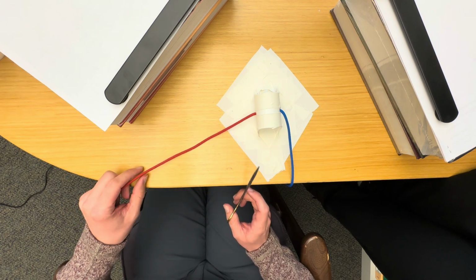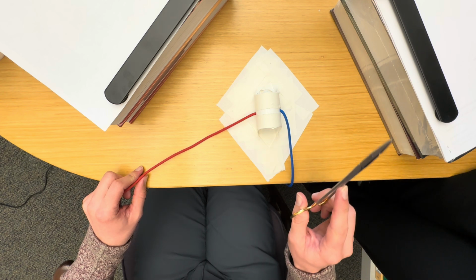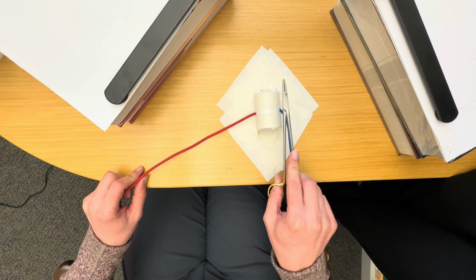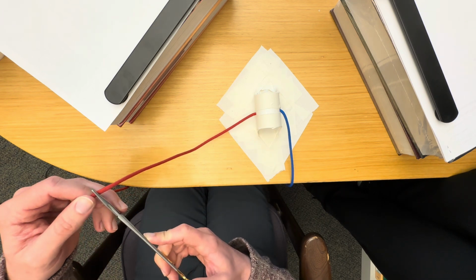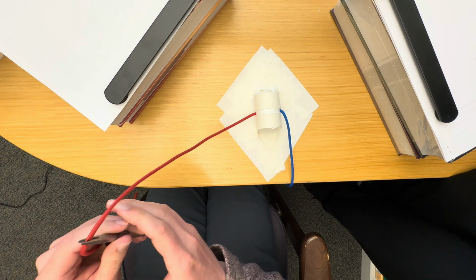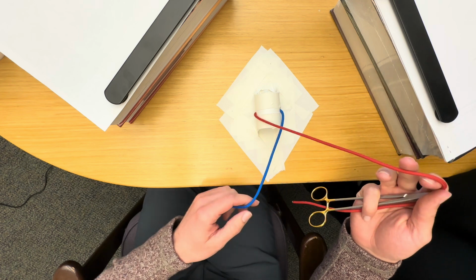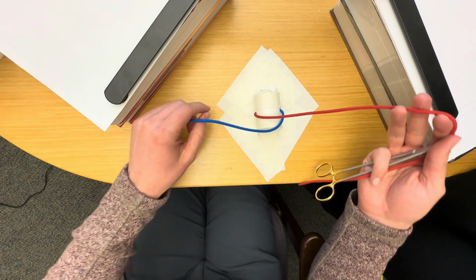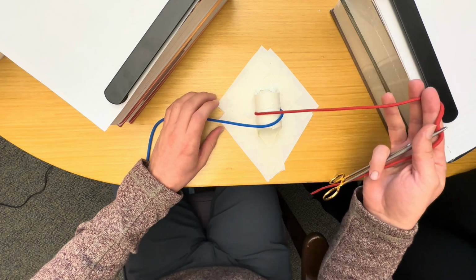So once again, going from a right-handed perspective, you have your needle and your needle driver. You're going to throw your first stitch. The needle will end up over on the left side, and then you have your needle driver over on your needle. The easiest thing to do is to once again cross it just like you would for your two-handed. And then once again, it depends on whether you cross the needle over or under your tail string.